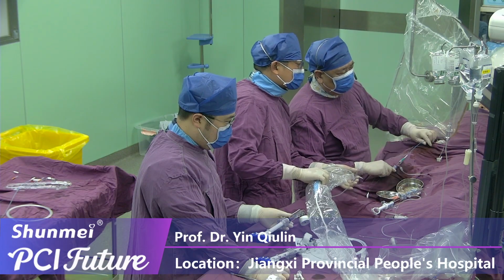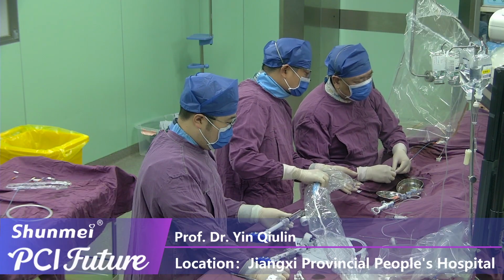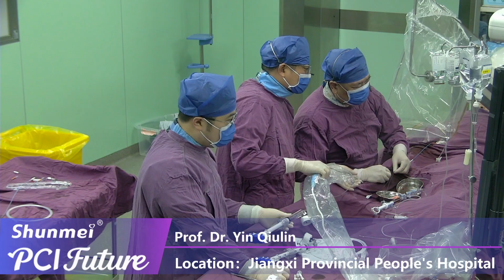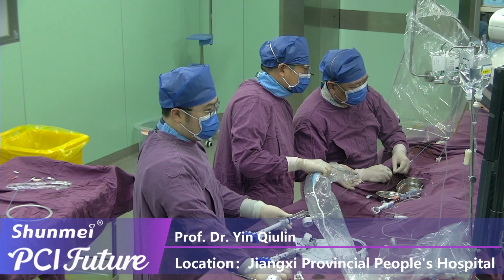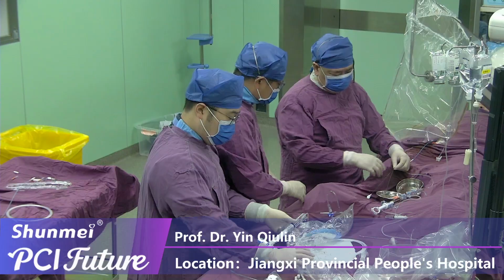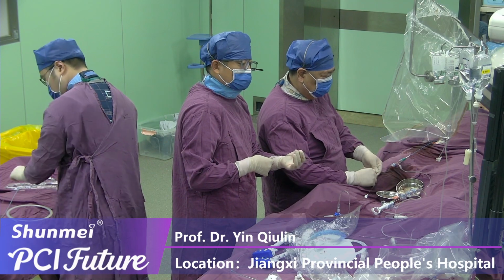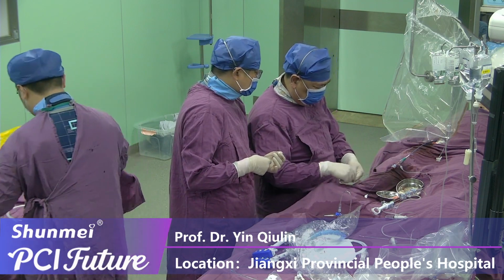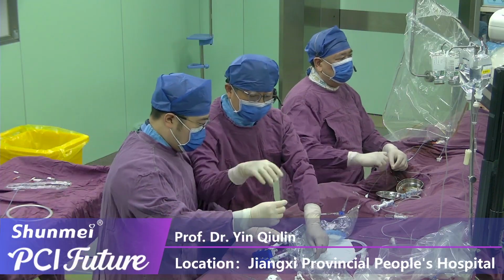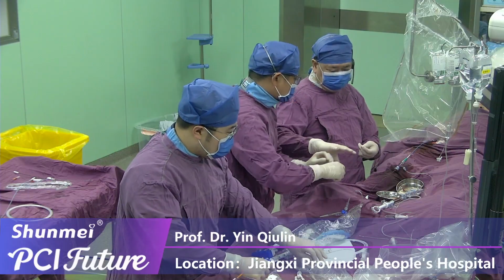Next page, please. The ECG finding: sinus rhythm, roughly normal ECG. Ultrasonography: first, mild mitral regurgitation; second, mild tricuspid regurgitation; third, decreased left ventricular diastolic function. LVEF was 60%. You can see the findings at RCA, a target lesion located at the middle segment of RCA with severe calcification.